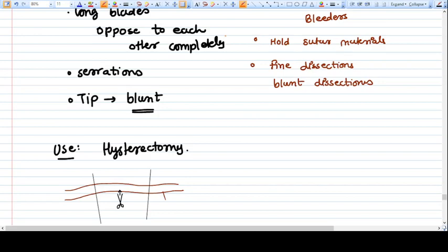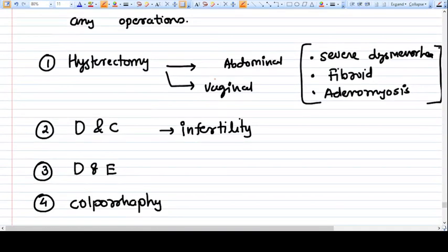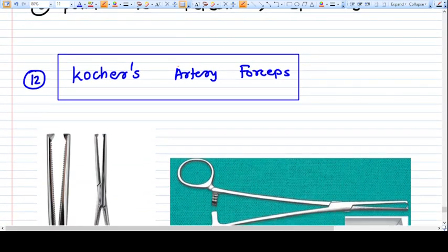These are two different designs of instrument that we use commonly. Now here is a third one, something called Cocher's artery forceps. Cocher's artery forceps has a combined design of both hemostatic forceps and Alice forceps.